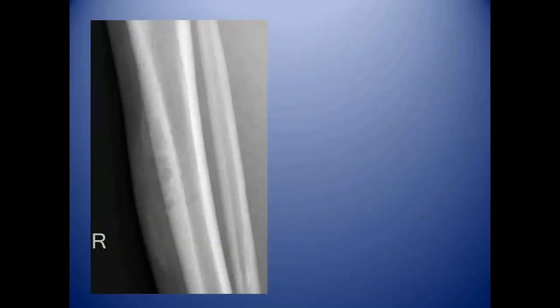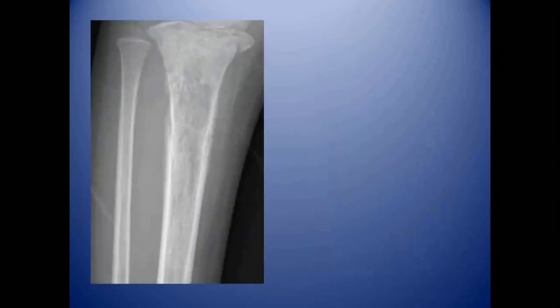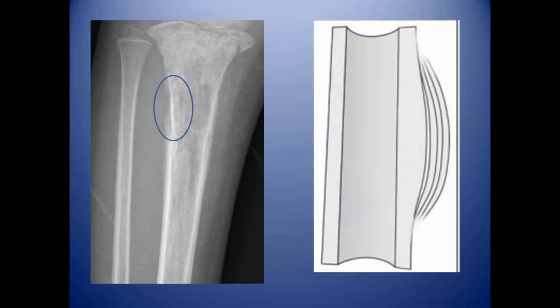This case of osteofibrous dysplasia involving the tibia shows a septated type of periosteal reaction. Those were the non-aggressive patterns. Now in the aggressive category, this case of Ewing sarcoma shows a multi-layered or onion-skin type of periosteal reaction, which is also interrupted in this area.